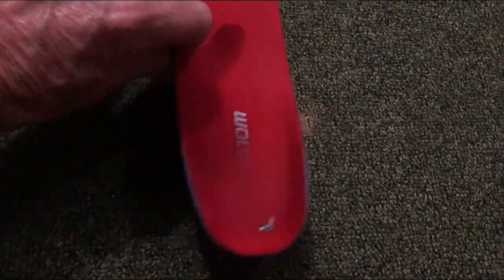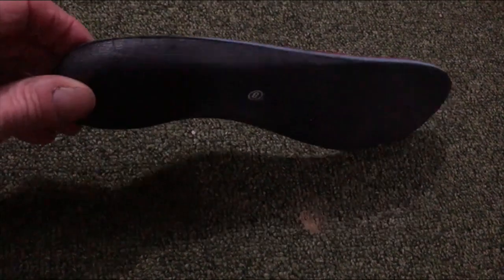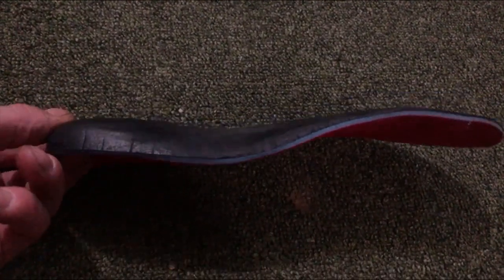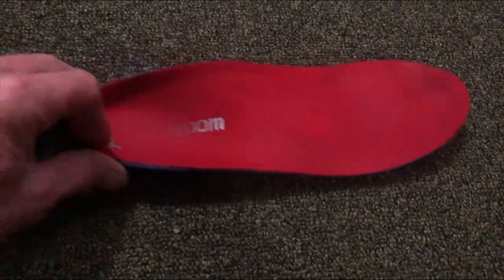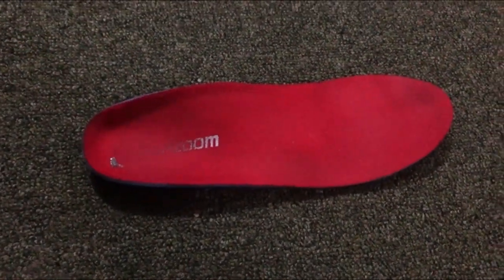It's got a 1.1 inch instep, raising up that arch very nicely. You can see it's quite high, but it's got a deep heel cup and it really fits in your foot nicely.